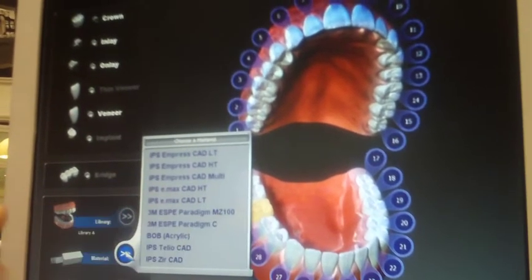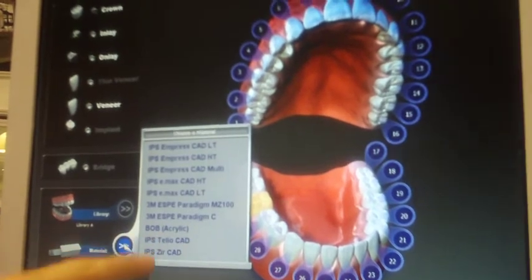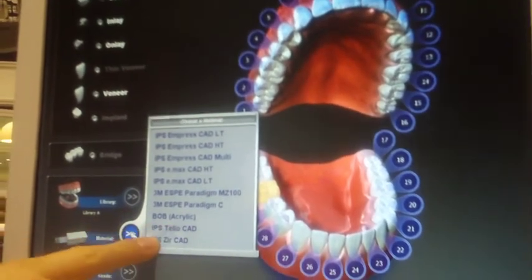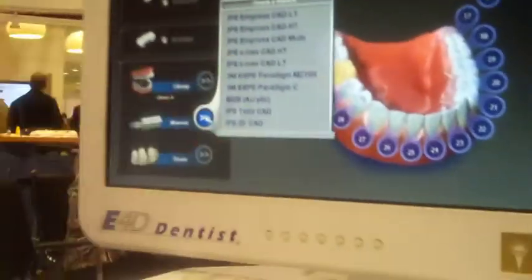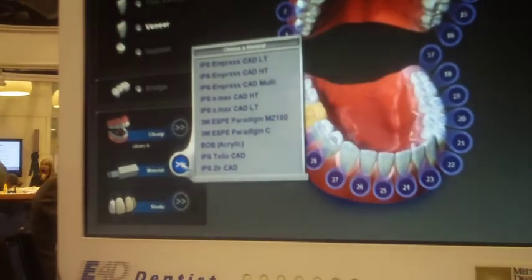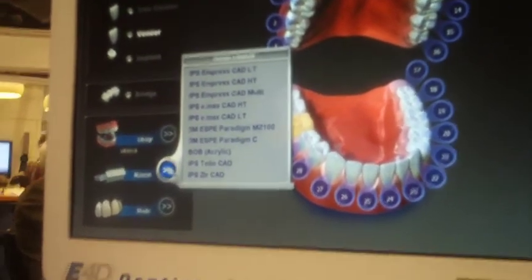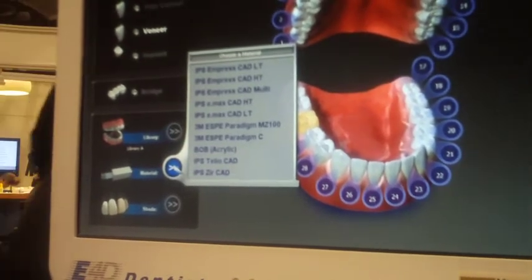The composite materials — I'll be honest — I don't really have any users that use them. The teleo is your temporary material for bridges, and then we have a burnout block. So if you want to have an all-gold crown, you can do full contour in a burnout block, get it to a lab technician, and it will burn it out exactly the same way as normal without having to do the wax-up.